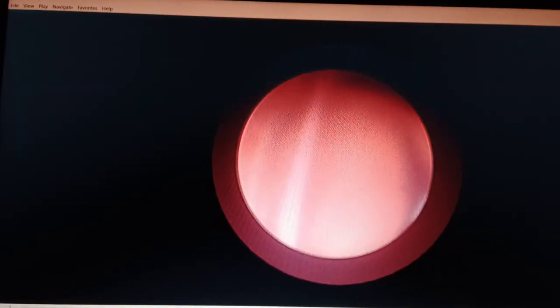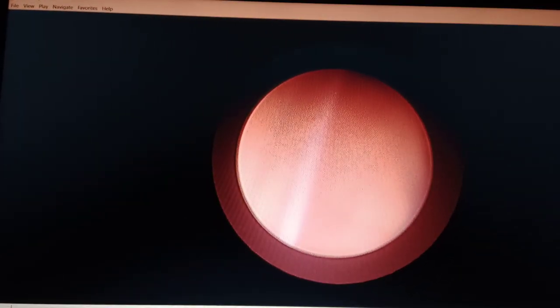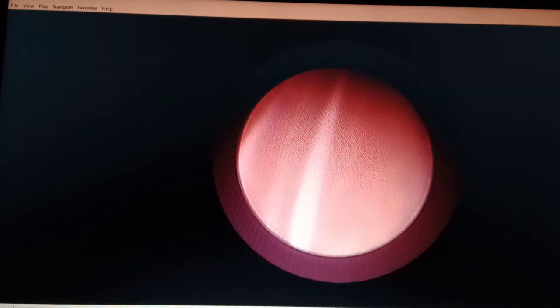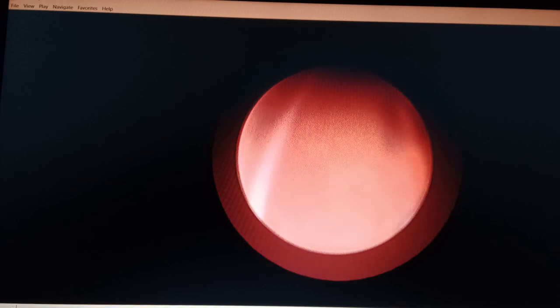The drainage port is not present in URS, whereas in a cystoscope drainage can be done whenever required without using feeding tubes. But in URS it is required to drain the bladder. When using a URS — ureterorenoscope — a smaller French size and smaller field of view is present compared to cystoscope. We are using around 9 French URS.